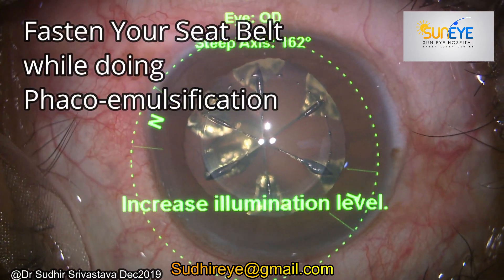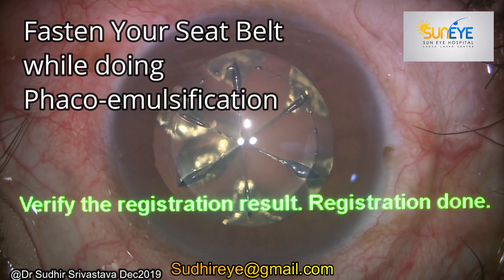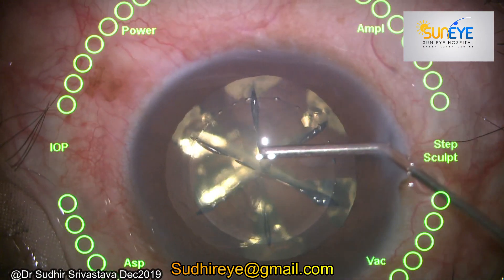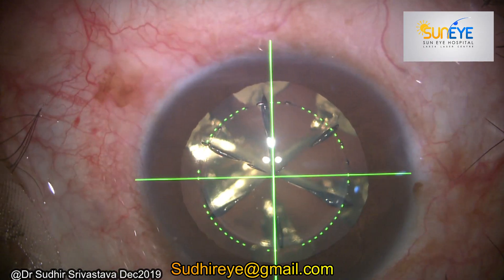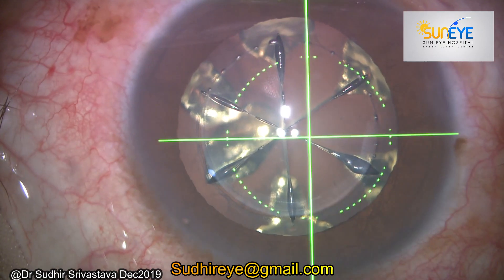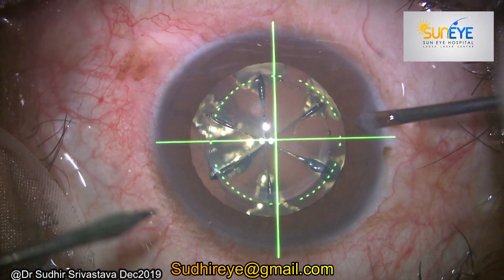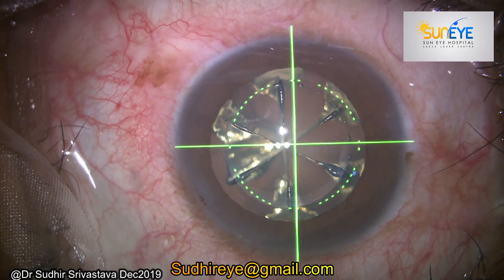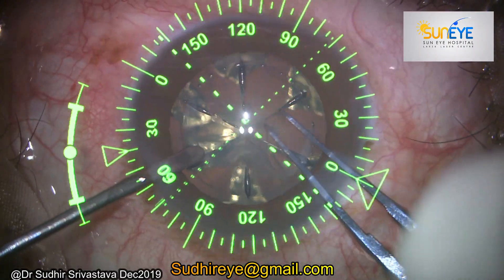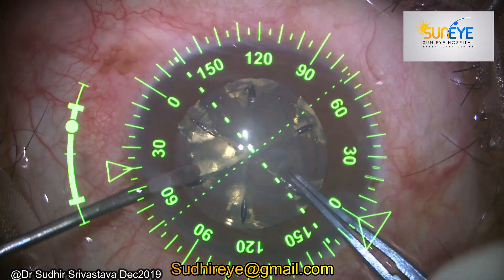Hello everyone, today I'll be sharing a very different video regarding safety during phacoemulsification. This used to happen with almost every surgeon's operating theater, although it's not very common nowadays. With modern FECO machines we are using very high vacuums and high powers, and surgical speed has increased significantly, so if you are doing surgery at a much faster speed you have to be more cautious.